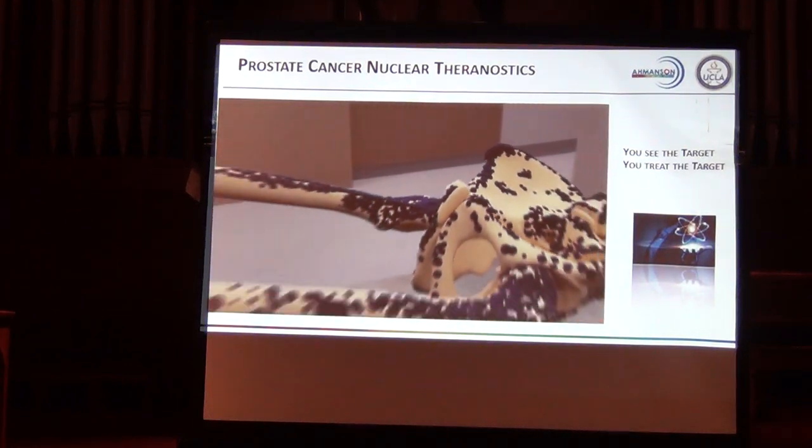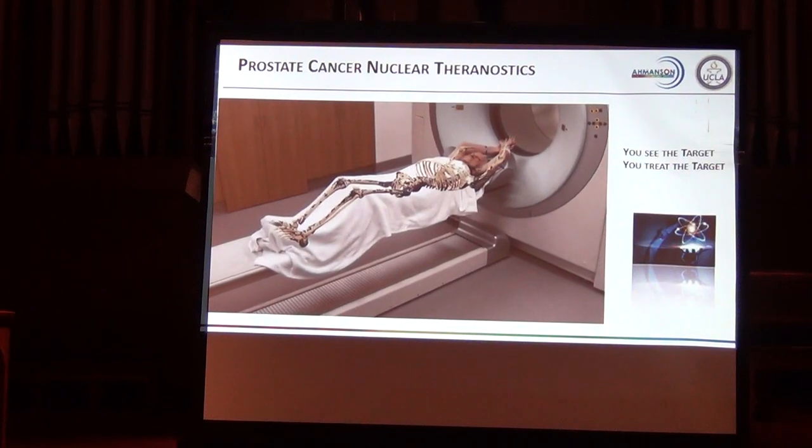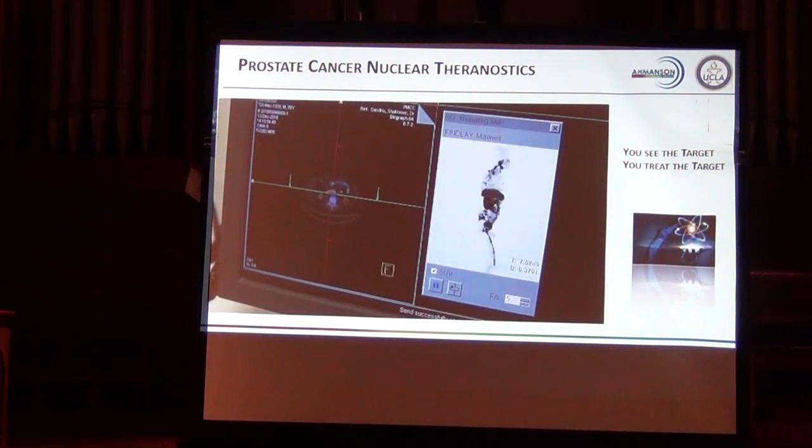In that case, you would see, for example, bone metastasis in the body of the patients. Then you do the CT, right? And then you create images like that.